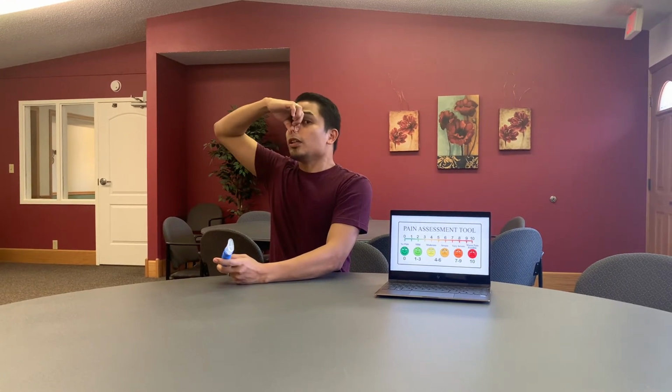First of all, we will tell the patient to do normal breathing for at least 3 to 5 times. When you look at the patient's breathing pattern on the graph, you take note of their expiration, and after that we will tell the patient to take a deep breath in. Let them think of it like they're drinking a soda via a straw. After taking a deep breath in, you tell them to blow as much as they can, or as hard as they can.